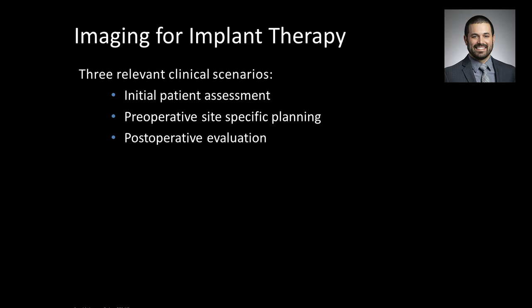Initial patient assessment, this is basically the patient walking in the door. And then preoperative site-specific planning, that's where you've identified an edentulous site and you want to place an implant. And then postoperative evaluation is where the implant's already there and you're just checking whether there's a problem or not.